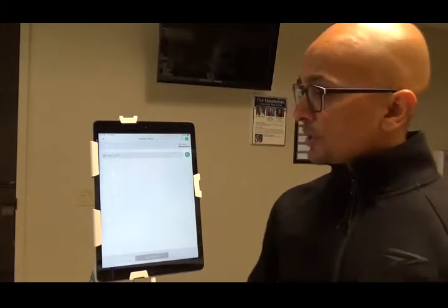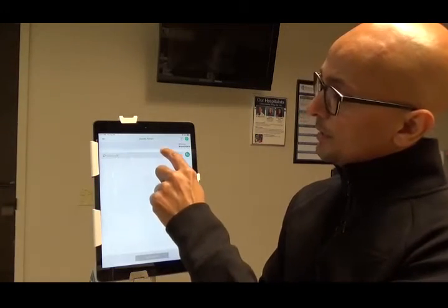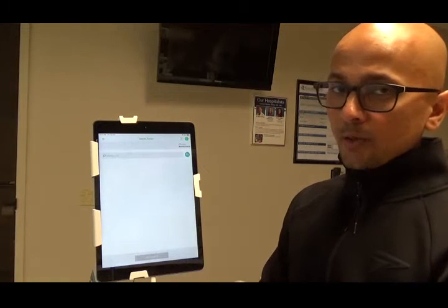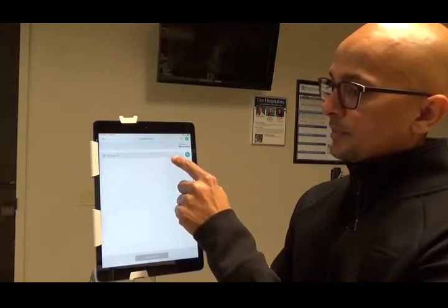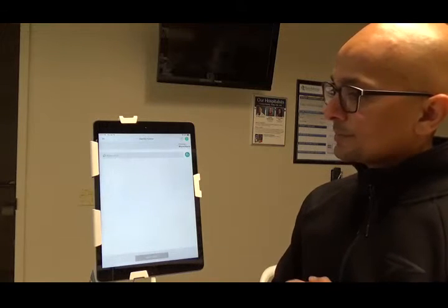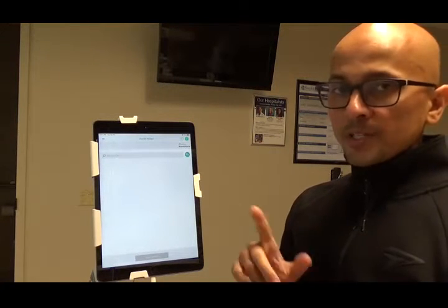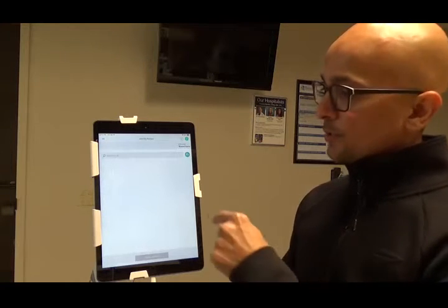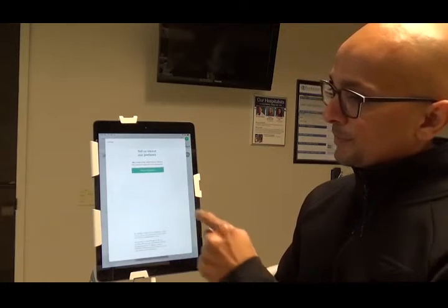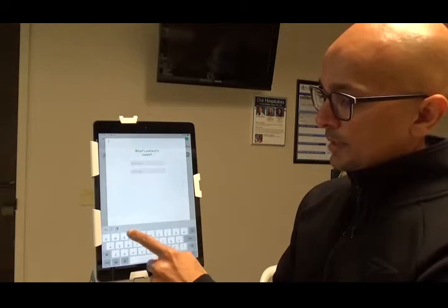So to start now, what we're going to do is we're going to use an existing, actually let me do this. Before we start any of the exams, let me show you how you enter a new patient. So first, click this. Tell us about your patient, add new patient.